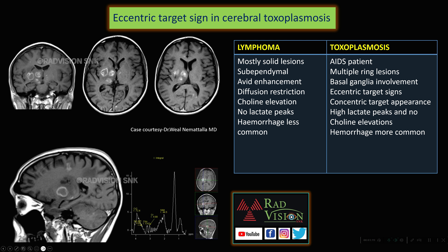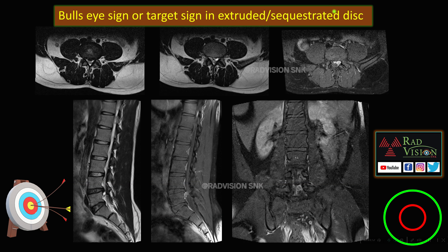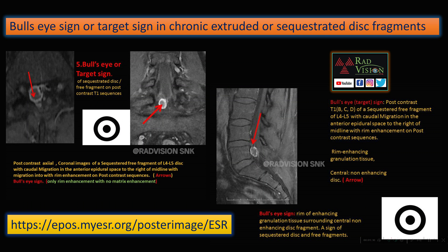Next target sign: the bullseye sign or target sign in extruded or sequestrated disc material. Here you can see this is the extruded disc showing peripheral rim enhancement and a central hypo-enhancing area, called the bullseye pattern or target sign. Whenever you are in doubt whether this is extruded or sequestrated disc material versus a neurogenic neoplasm, advise contrast. If you see this bullseye sign with peripheral enhancement — which is granulation tissue — and a central hypo-enhancing area — which is the disc material — it is classical for chronic extruded or sequestrated disc material and is not typically seen in neurogenic neoplasms or metastases.